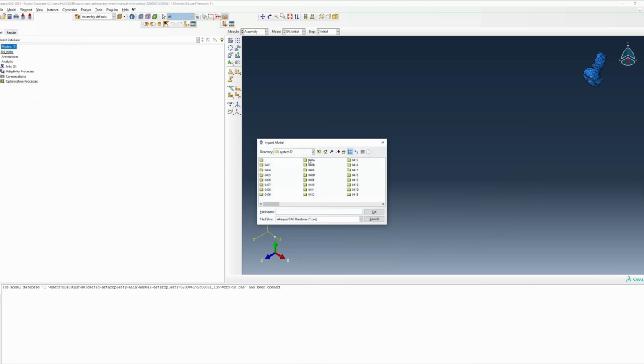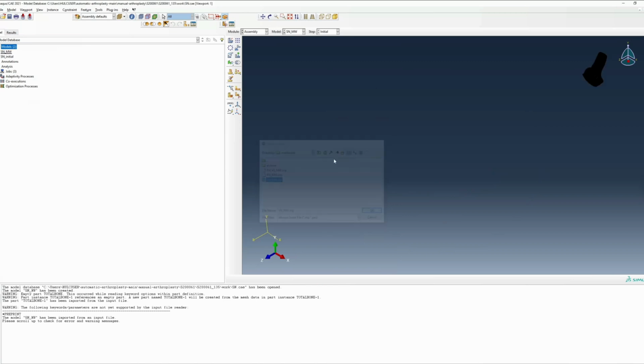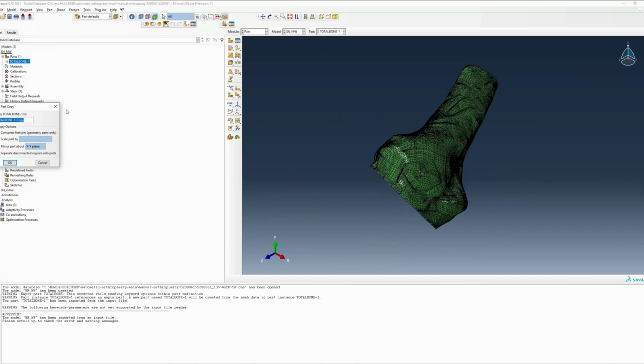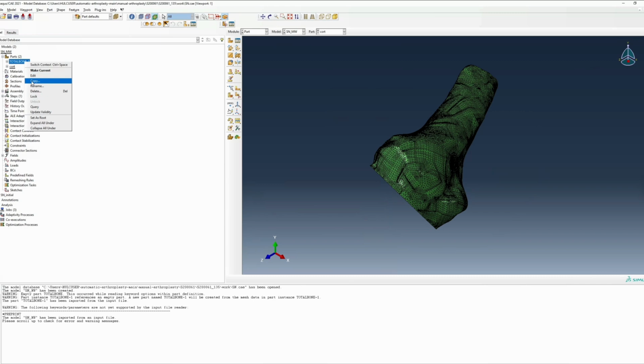After creating your orphan mesh, from the Model menu, open up your orphan mesh and re-import your .inp file as another model. Your new model file will contain your total bone mesh that you produced in the last step. Copy this part twice and rename your two new parts as Cort and Trab, or some similar naming convention.